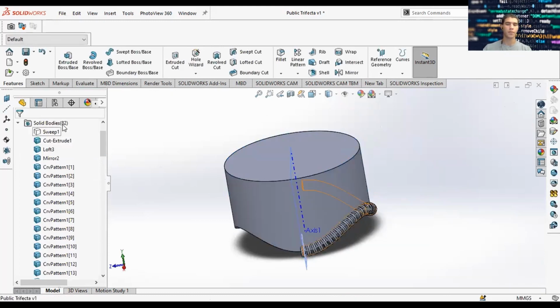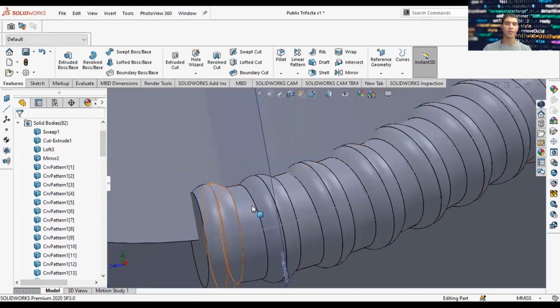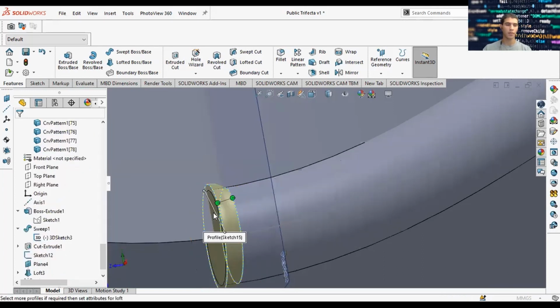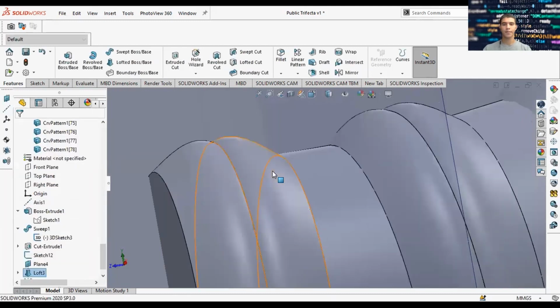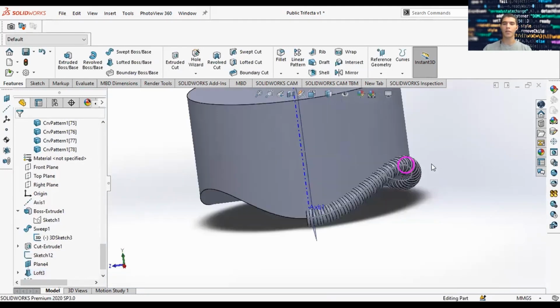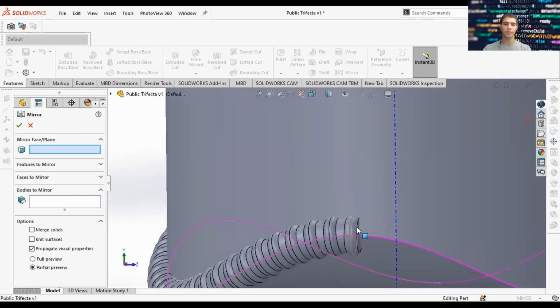We'll bring back our sweep function. Now it's starting to look more like a cuff. Let's go ahead and edit our feature a bit. There we go. And so now we have a cuff throughout half the cylinder. Now we're going to repeat this for the other half.